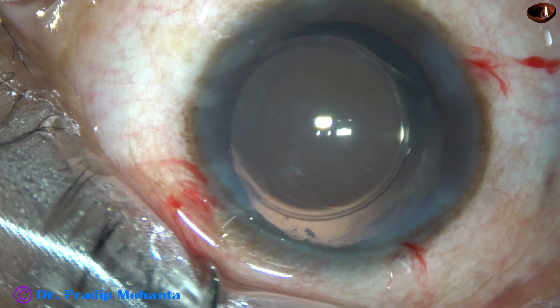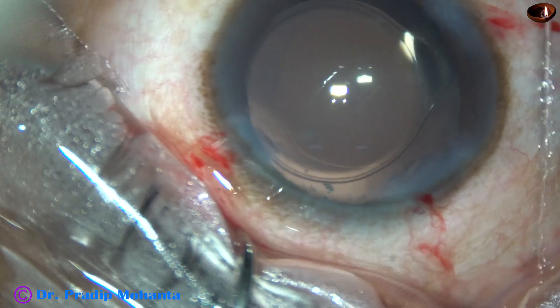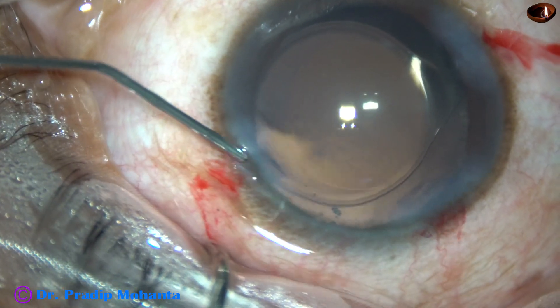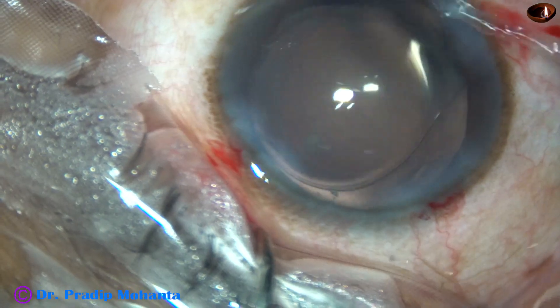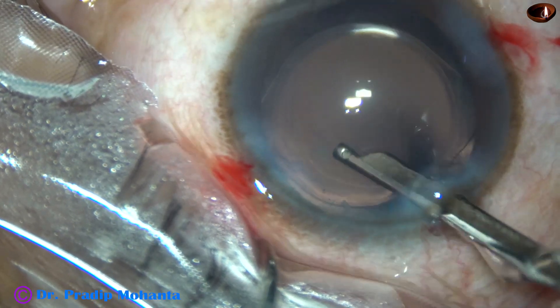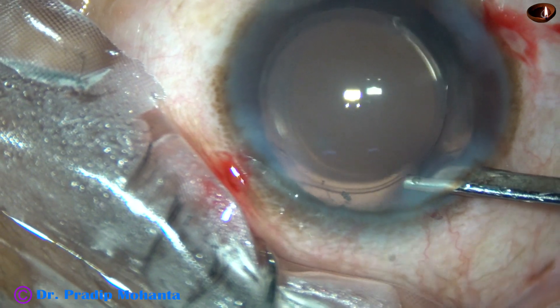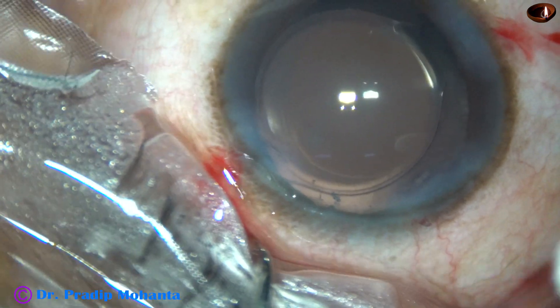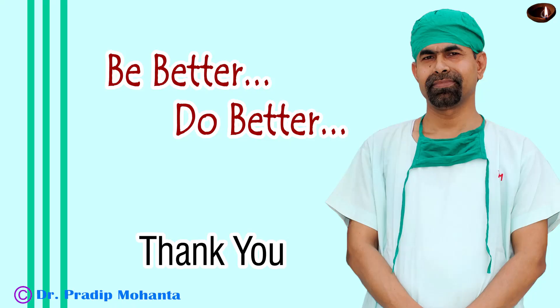This is a bit of moxifloxacin. Now the side ports are closed by hydrating the corneal stroma with balanced salt solution. The main wound usually doesn't need any hydration — it has been constructed in such a way that it will seal by the high intraocular pressure. As we form the anterior chamber nicely, the main wound is nicely sealed. Now check the integrity of all the wounds, and a few drops of moxifloxacin are applied over the cornea and the case is concluded.